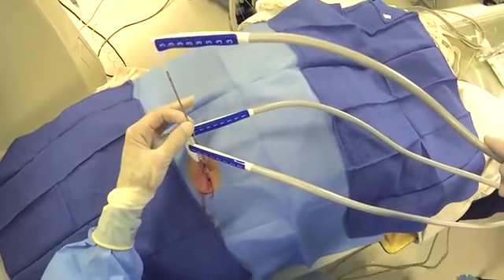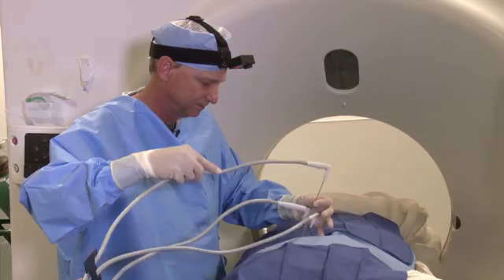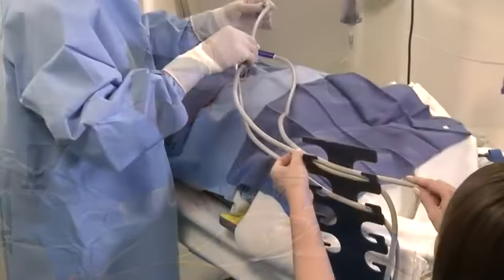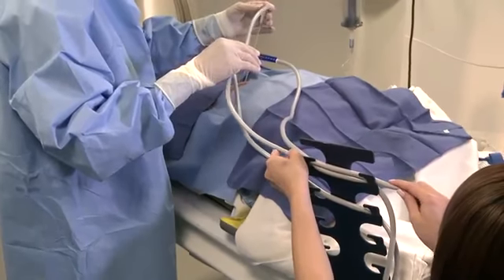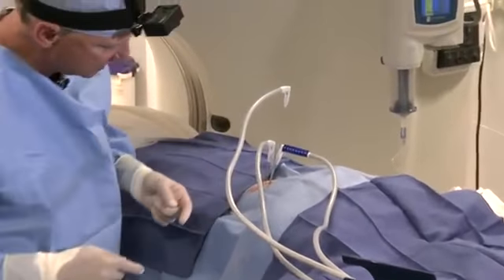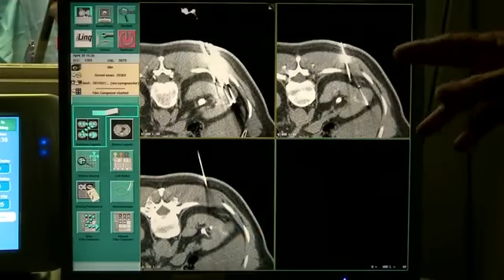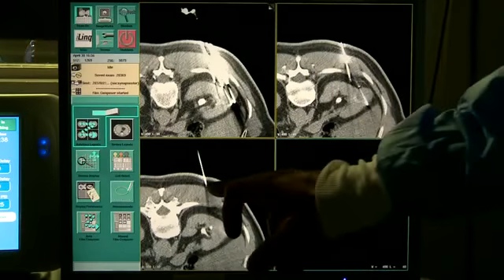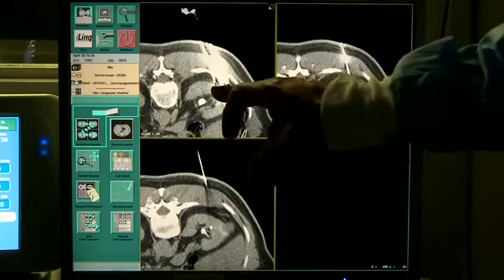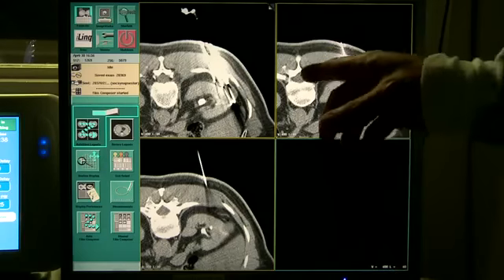How am I doing there with the angle, Michelle? Does that look good? Okay. All right, let's do a set on that top needle, thanks. So the 3rd probe was placed, and this is its skin entry on the upper part, and it's descending. I didn't place it in a descending way, but it is descending.